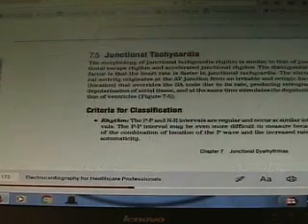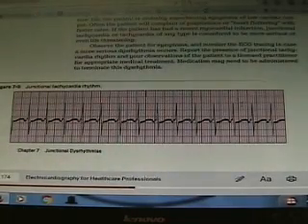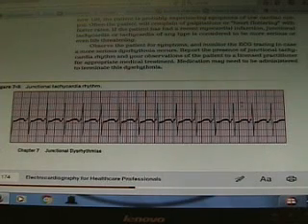Now let's look at junctional tachycardia. Of course, that's going to be even faster. And what was the main thing? Do you see now a theme on a junctional rhythm? The P wave is not going in the right direction. It's not going SA to AV, the bundle of His. It's spreading out in an opposite direction, and it's fanning out in your atria. So the P wave will always be upside down. And now you have something that looks like tachycardia.